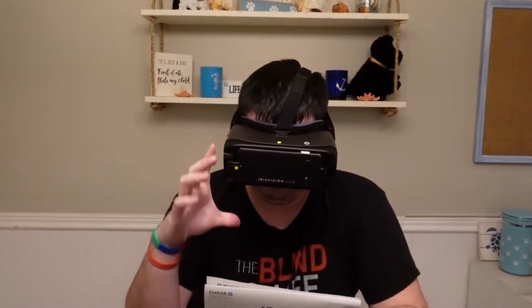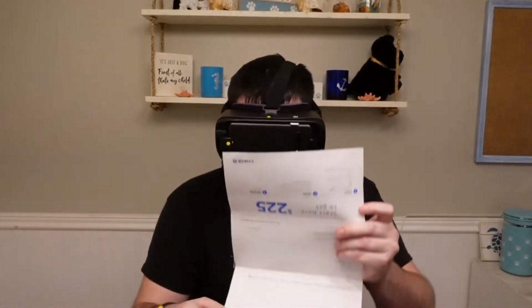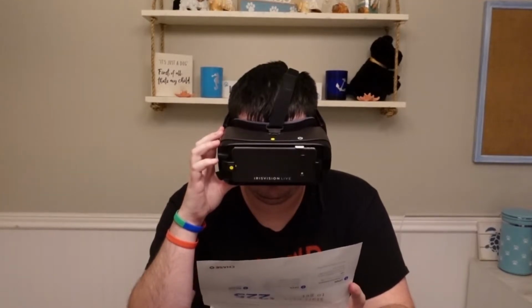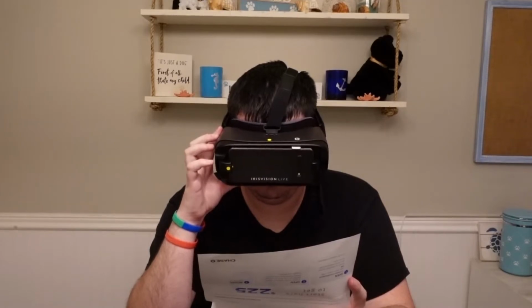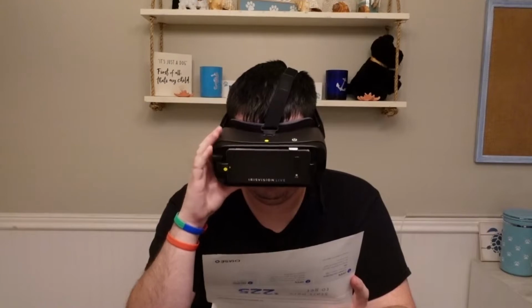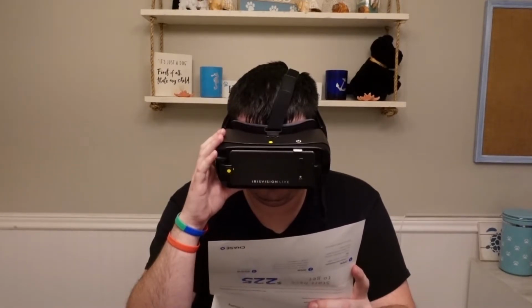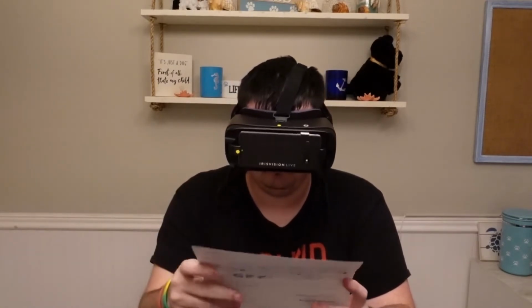Iris Reader. So Iris Reader uses optical character recognition to display captured text to the reader, which reads it aloud one word at a time. The word being spoken is highlighted on the display. So cycle to this mode and center the text you would like to have read in the screen. If possible, bring the reading material within 8 to 10 inches from your headset. Make sure the text is not cut on either side of the screen.